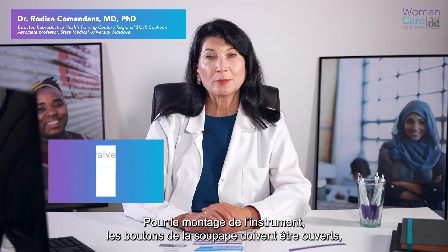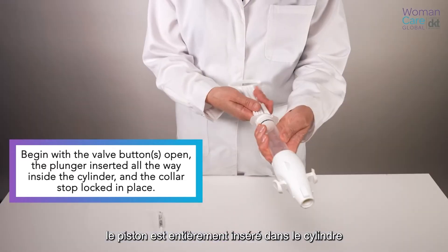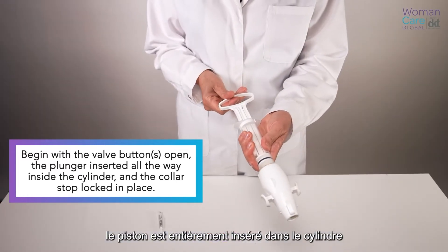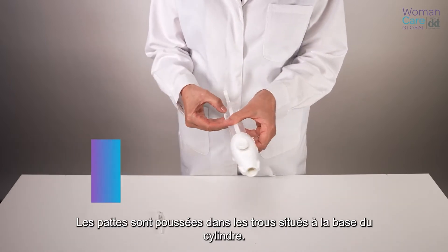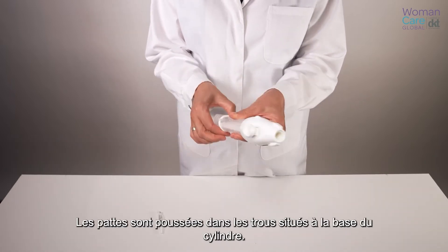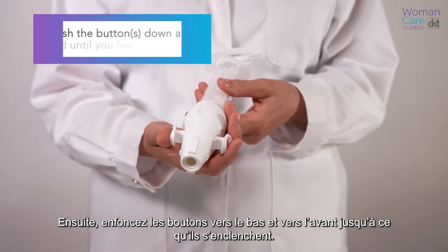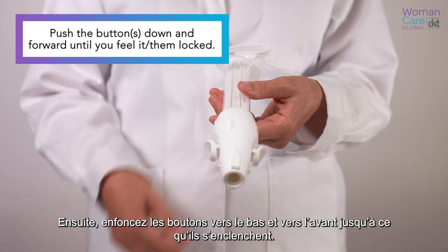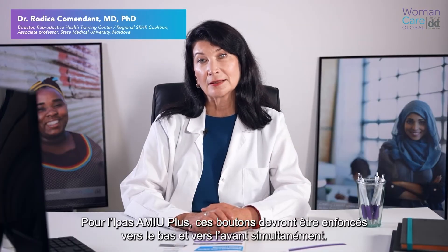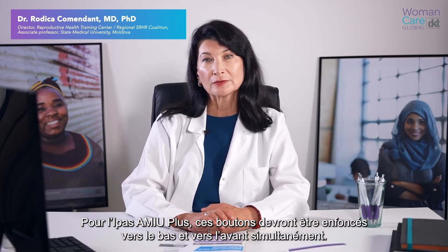For instrument assembly, begin with the valve button or buttons open, with the plunger inserted all the way inside the cylinder and the collar stop locked in place, with the tabs pushed down into the holes in the cylinder. Next, push the button or buttons down and forward until you feel them lock. For the IPAS MVA+, these buttons will need to be pushed down and forward simultaneously.